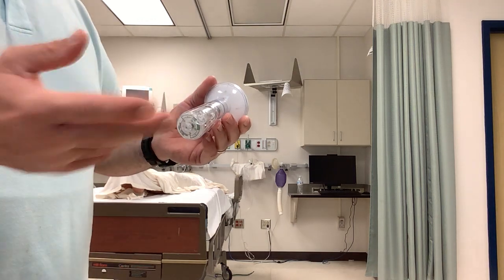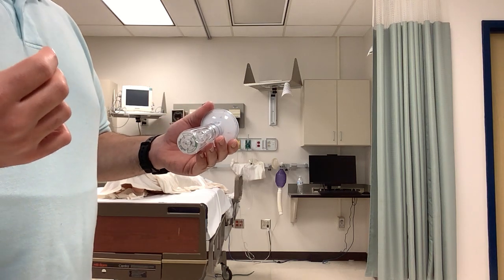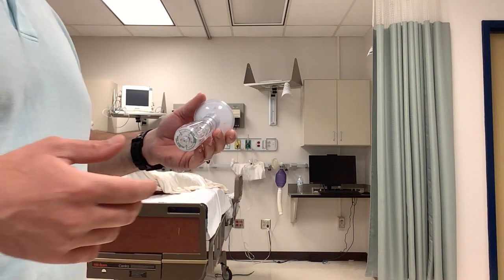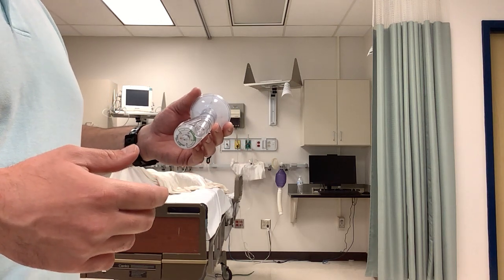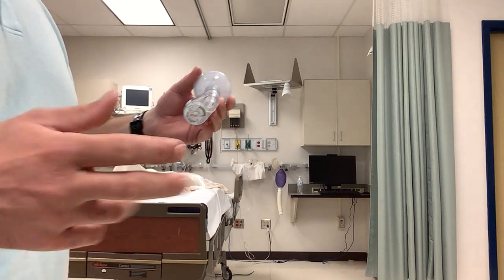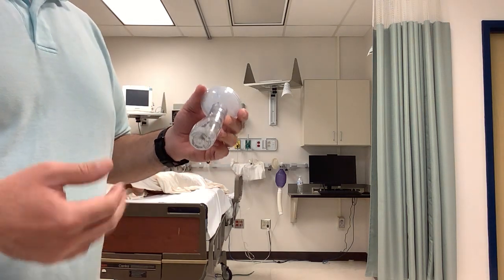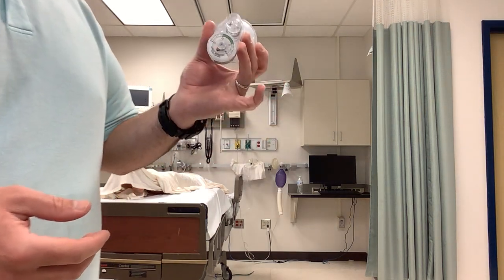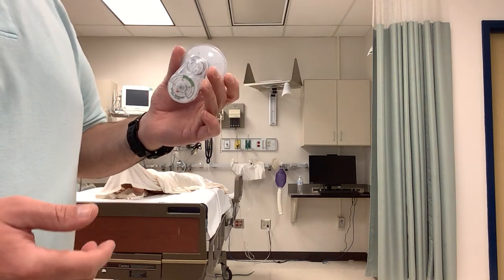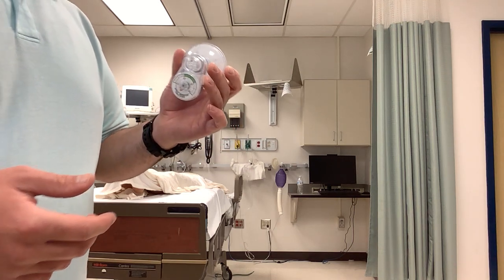With the NIF-meter, you can also do vital capacities, assessing overall lung function. Some individuals get neuromuscular disorders such as Guillain-Barré syndrome, myasthenia gravis, Lou Gehrig's or ALS — anything that could potentially impact the patient's ability to spontaneously breathe. So we do a negative inspiratory force, NIF or MIP — maximum inspiratory pressure — to determine how strong they're able to take a breath in.